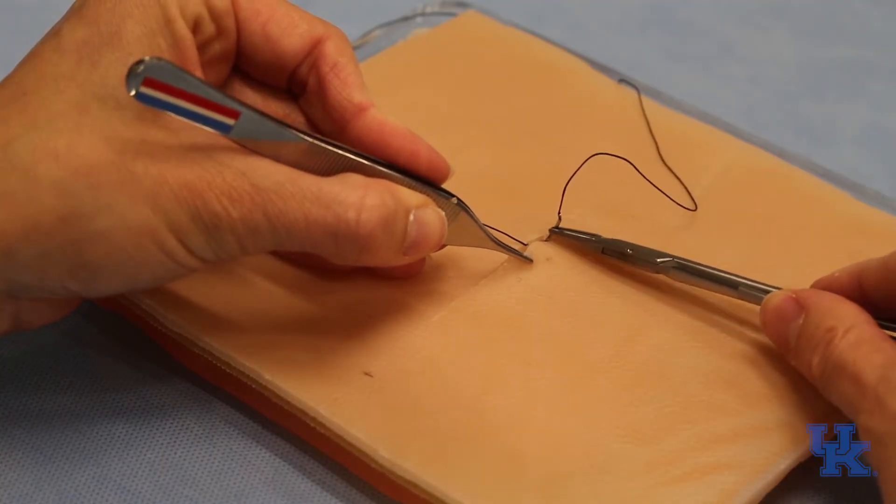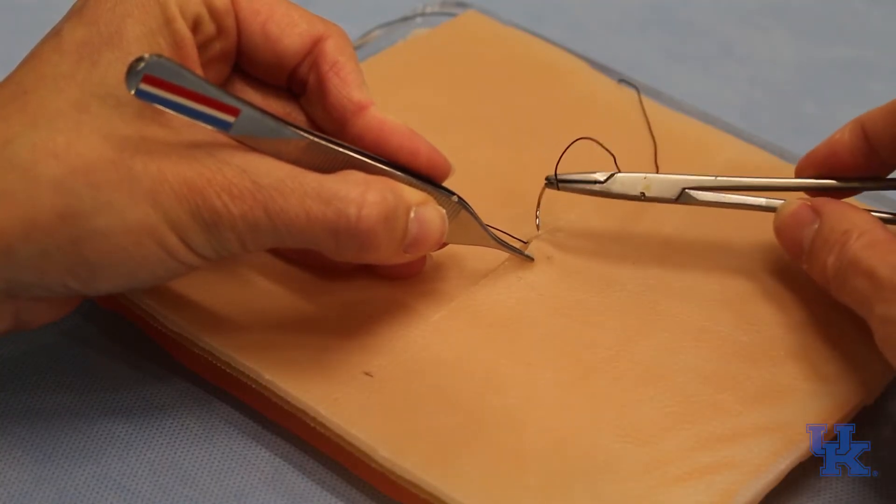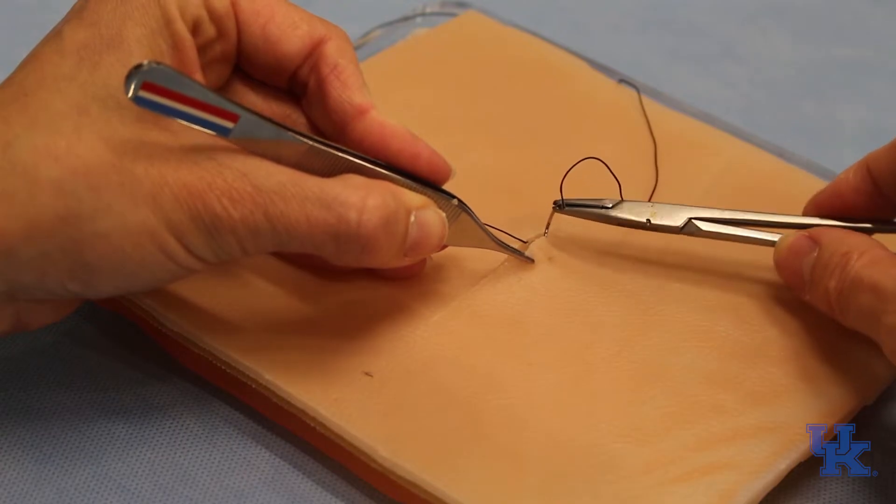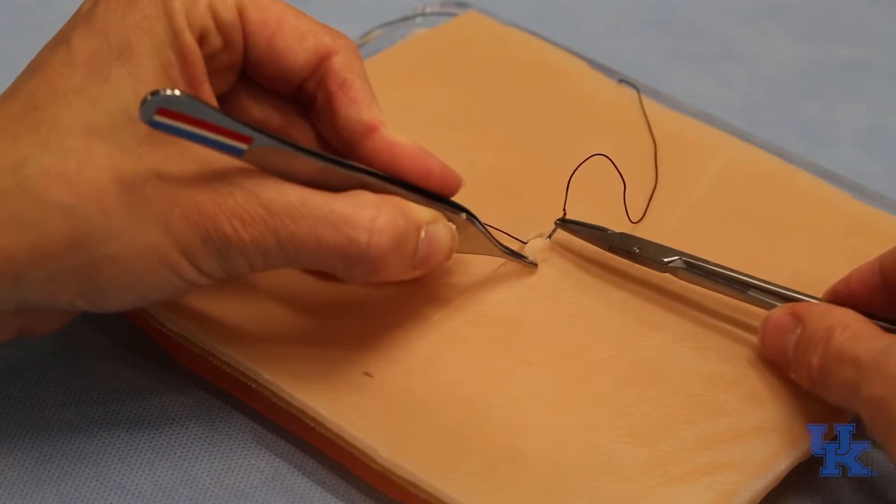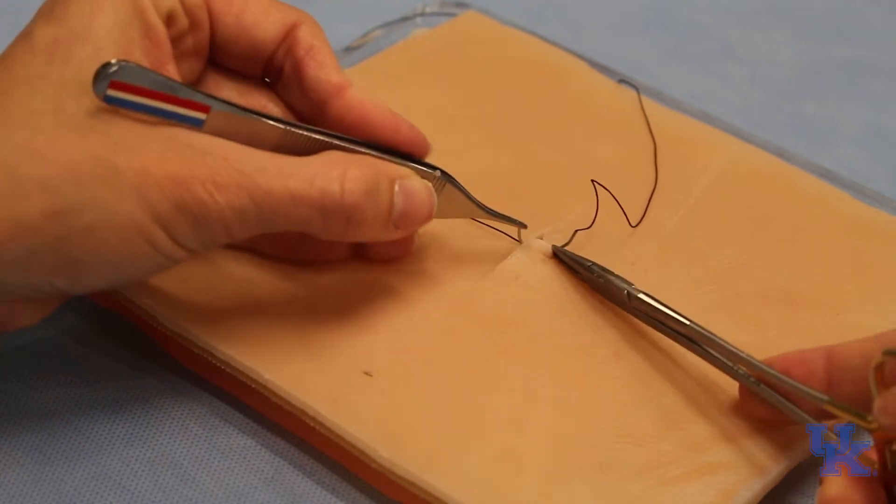Now what I see often is people want to do this. They want to skive. You want to try to get this to go in somewhat perpendicular. Rotate so you actually get some tissue, come back out at the skin edge.